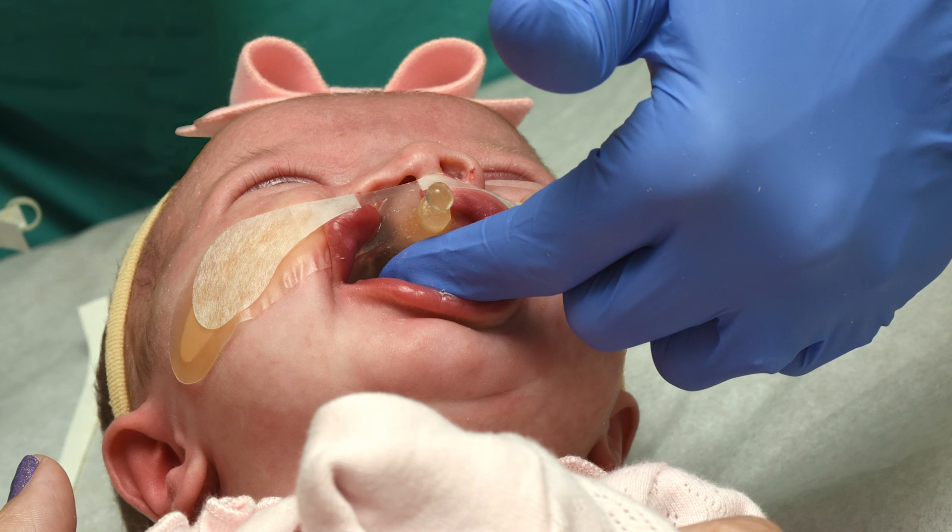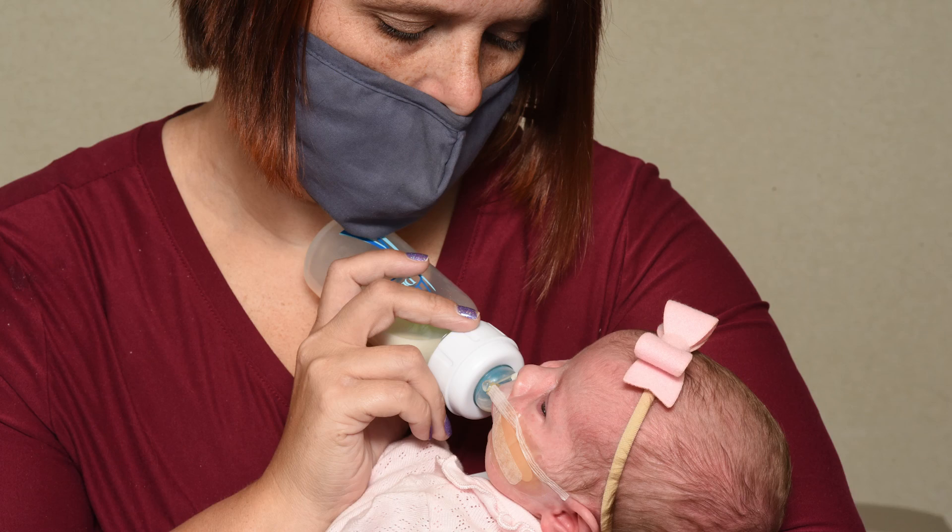Regular adjustments are essential to accommodate the baby's growth and achieve the best possible outcomes. These gradual processes of bringing the lip and the gum segments together and elevating the nose helps prepare your child for surgical repair with a plastic surgeon.